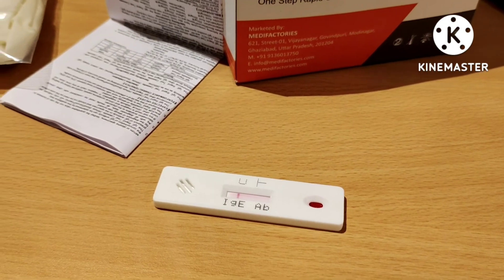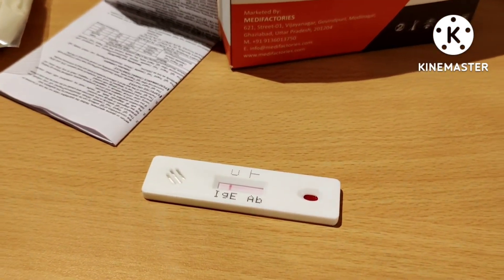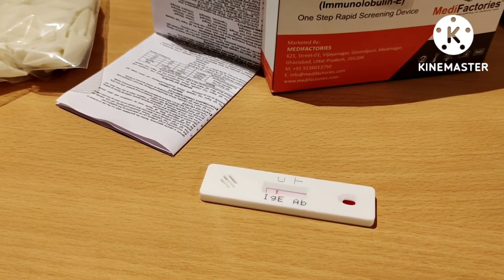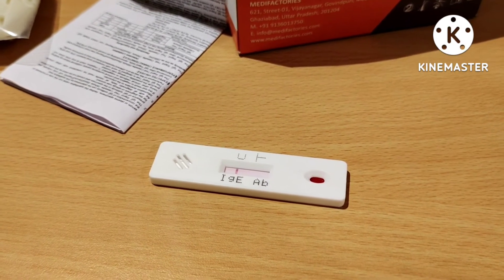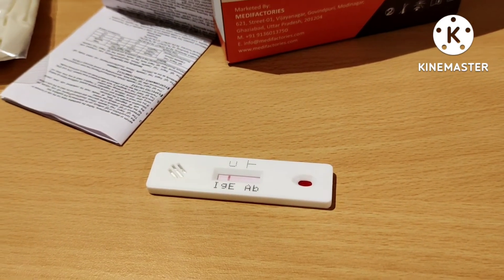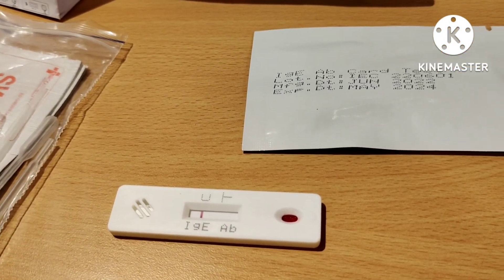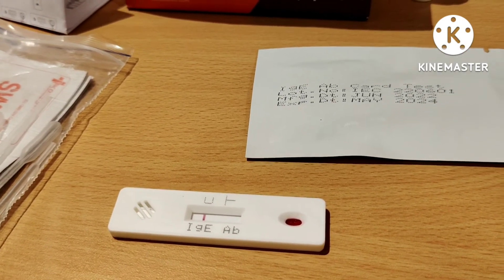Here you can see a band has already appeared, but we still have to wait for 5 minutes to get a clear band. You can clearly see we are getting the control line but not the test line — still, we have to wait the full 5 minutes for a confirmed result. After 5 minutes, here you can see the clear band of the control line, and the test line is absent. This means the test is negative — the person tested was not having any IgE allergic reaction or elevated IgE amount in their blood.